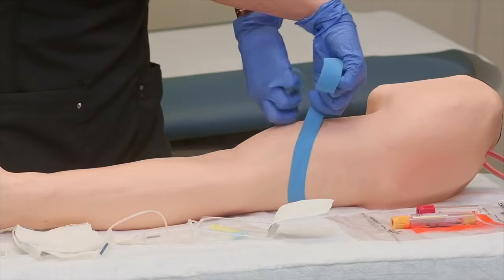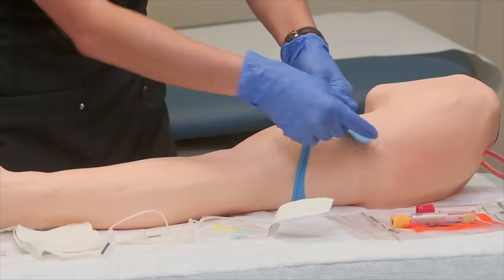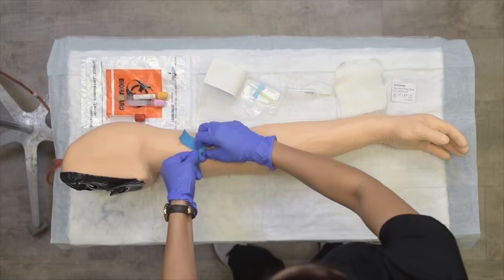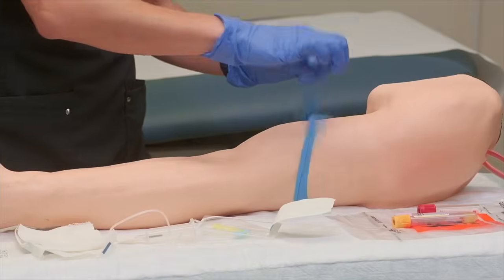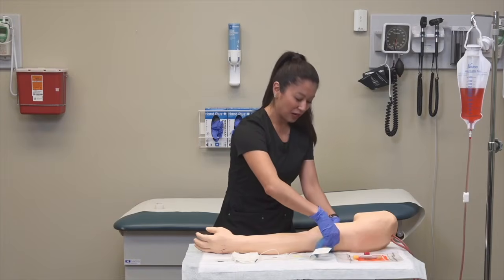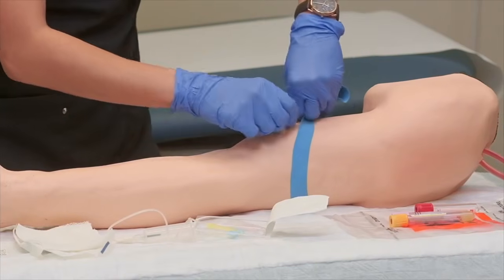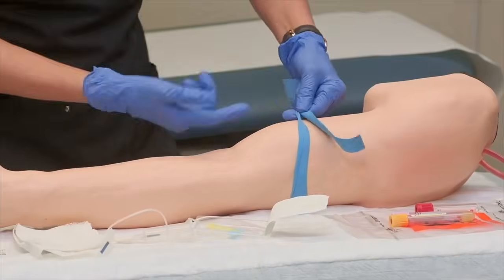Then I like to cross my hands and gather it in one to where you see a nice X. Then I'm going to poke through just this little side here. So when we're done, we can quick release. And again, I'm going to show you the tourniquet one more time. I'm going to grab the side here just for a little bit more tension. I'm going to cross my hands, and I want to just make sure we gather this in an X-like fashion.